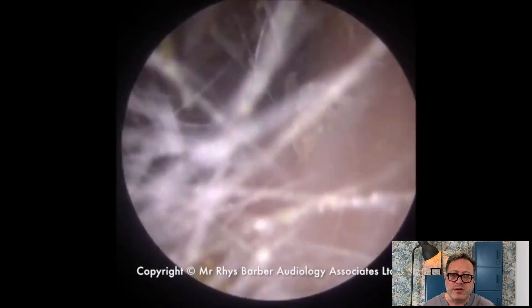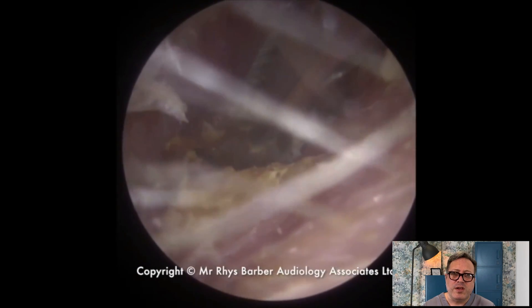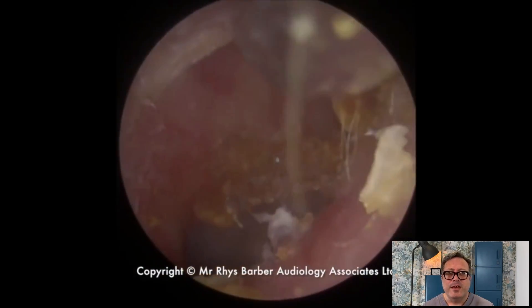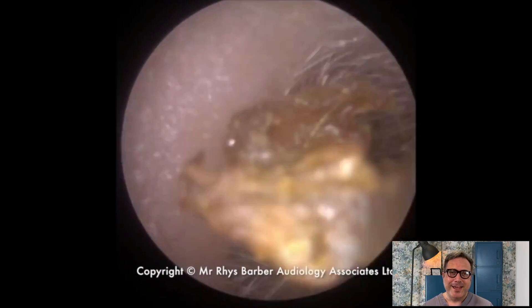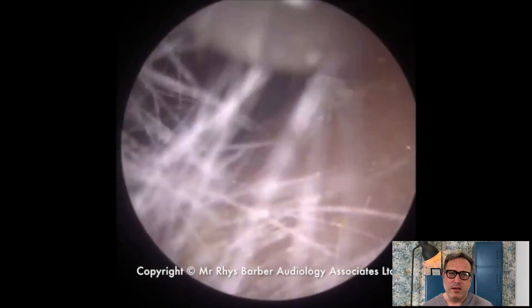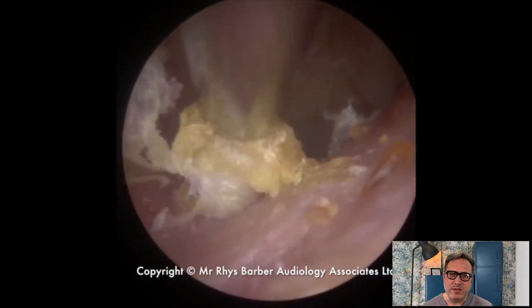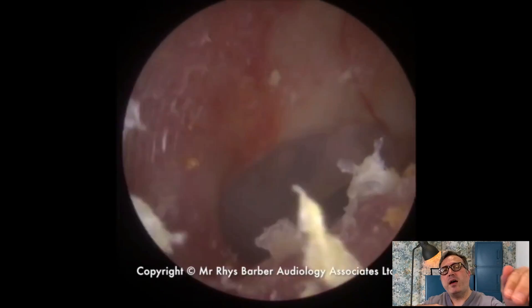I think that's one for the crocodile forceps. We're just going to grab that section — I think this is going to be a quite thick, wide piece by the looks of it. Yes, there it is — you can see the dry skin on either side that was holding all this in. We've got this little dry piece at the top — brilliant, that pulled towards the section with just enough grip. That's come away really nicely. Now there's a little section at the bottom of the canal — we're going to lift that up. You have to be quite careful because sometimes they can be really attached to the canal wall, and when you lift it takes away a lot of old dead skin and you can get a little bit of bleeding. Wow, look at that coming away — you can see the skin behind is much, much thinner.